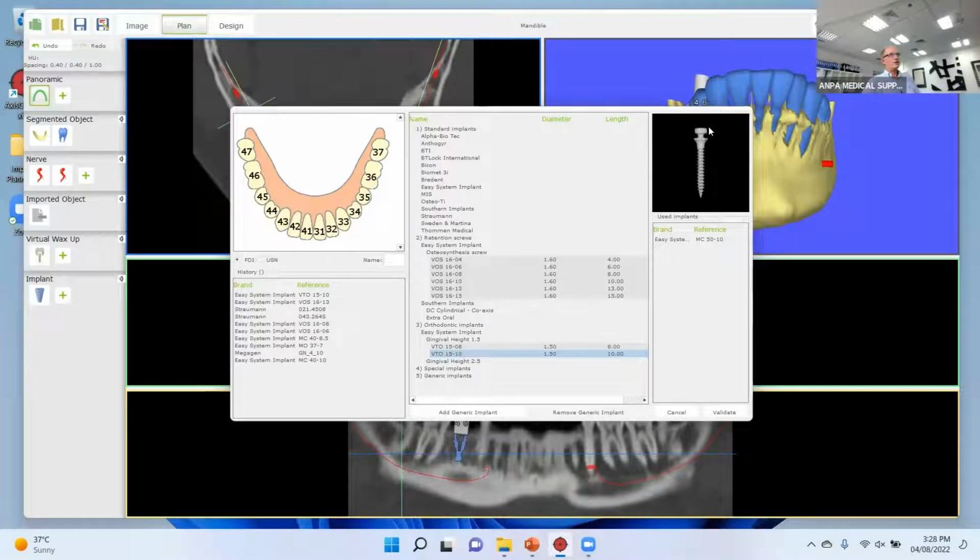Why? Because with a screwdriver, you can screw them on top, and there is a hole here, okay? So you can put a wire and attach it in a very easy way. You can screw them in an easy way, and you have this gauge here, okay? And you can put an elastic also. So this is the design I'm looking for in orthodontic implants, okay?